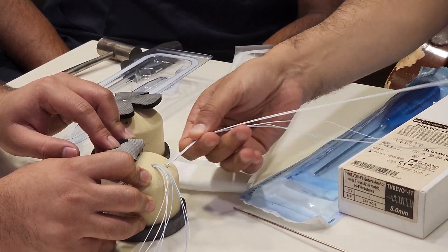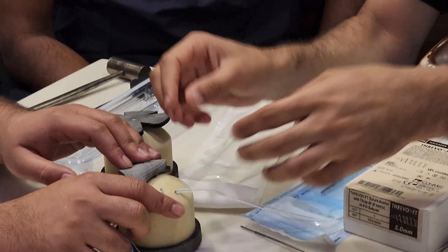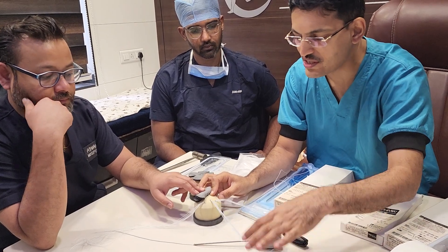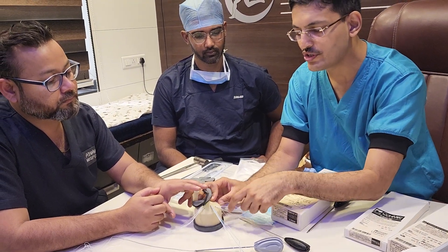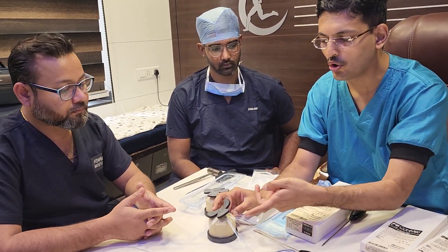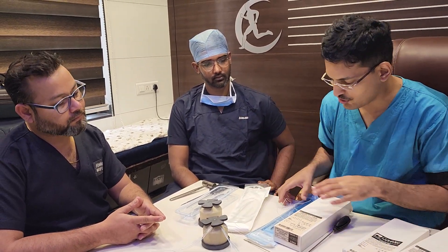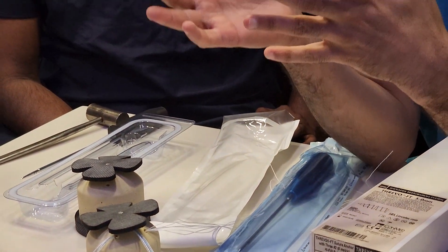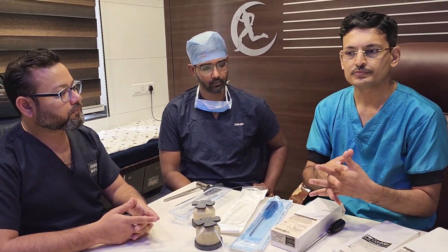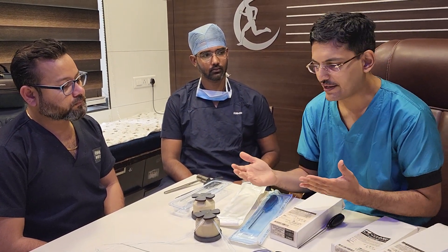One notable advantage of Linvatech anchors is that most anchors are available in a triple-loaded pattern, whereas most other companies offer only double-loaded anchors. All three configurations — metal, all-suture, and PEEK — are available as triple-loaded anchors. You can perform single-row repairs or double-row repairs by combining these anchors with the knotless Pop Lock anchor, which is developed by Linvatech for lateral row fixation.